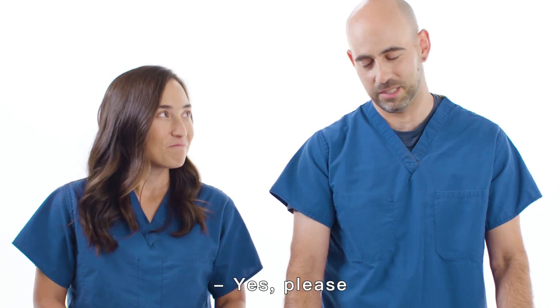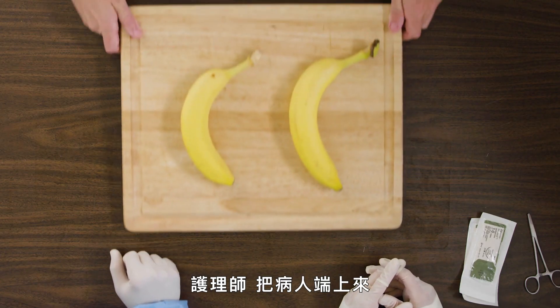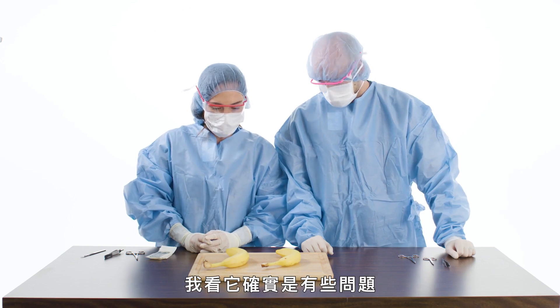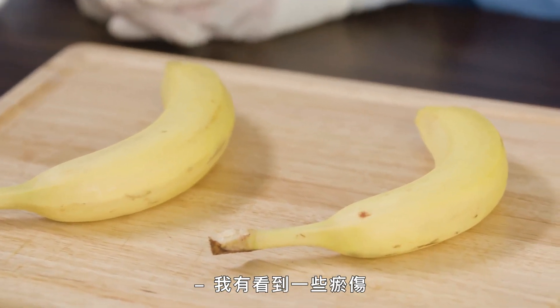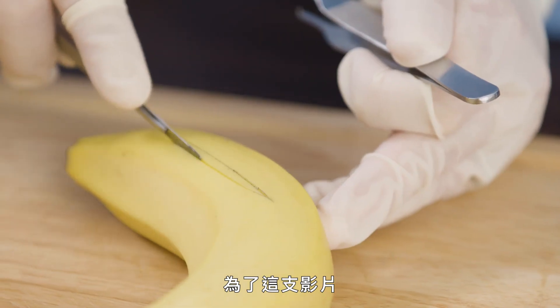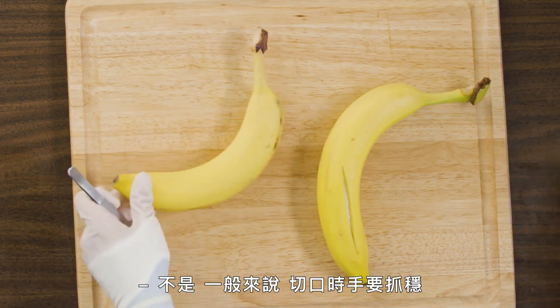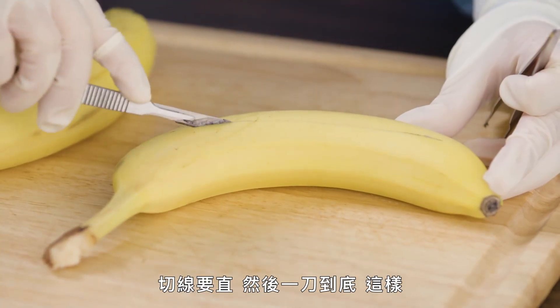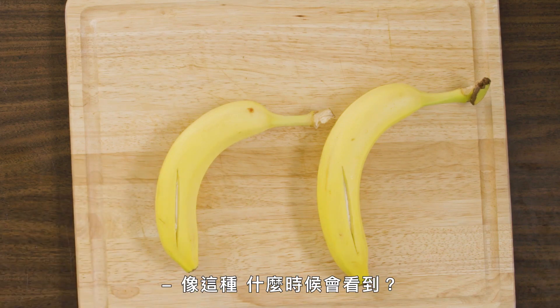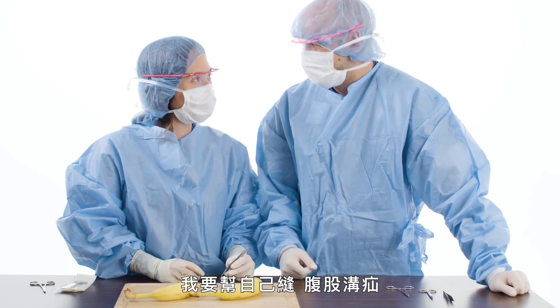Are you ready for the next lesson? Nurse, bring in the patients. I've never seen anything quite like this, doctor — the most severe case I've seen yet. So for this particular model, we're going to make a little laceration then close it up. Sometimes you have to hurt things to heal them. Two bananas were harmed in the making of this video. Normally an incision is with a firm hand, a straight line, all the way down — it just depends on the operation. In a skinny guy like you — inguinal hernia. Well, let's just pretend I'm stitching up my own inguinal hernia.